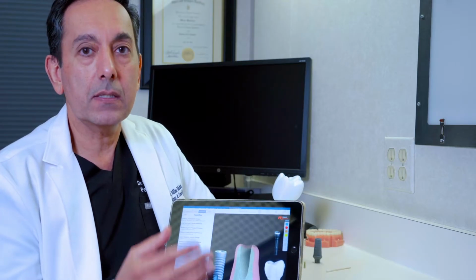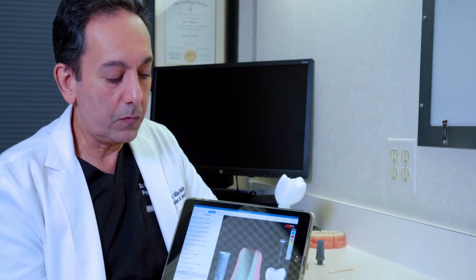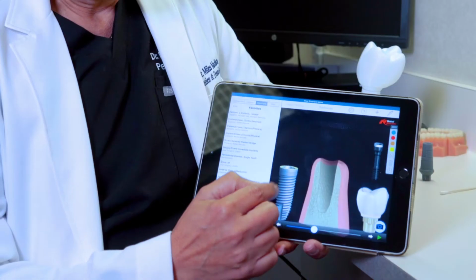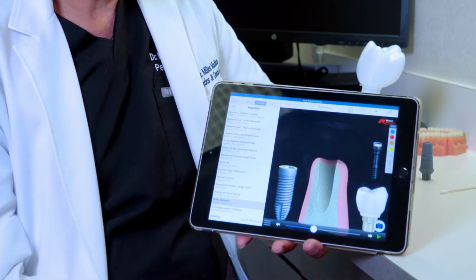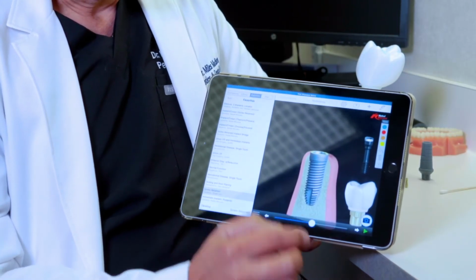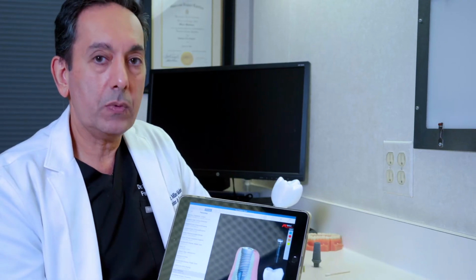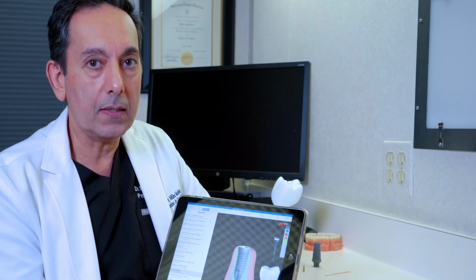These come in various sizes and widths and lengths, so every patient gets one specific for their use. The important thing with a dental implant is that they have threads that engage the bone, but they also have a surface that eventually forms an actual chemical bond to the jawbone, so it gives it a lot of stability. So the implant is placed. And then it takes anywhere, depending on the case, anywhere from 6 weeks to 3 months for the jawbone and the implant to fuse together.